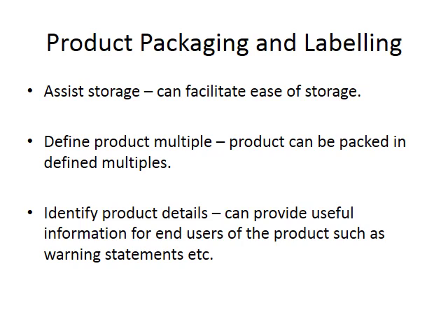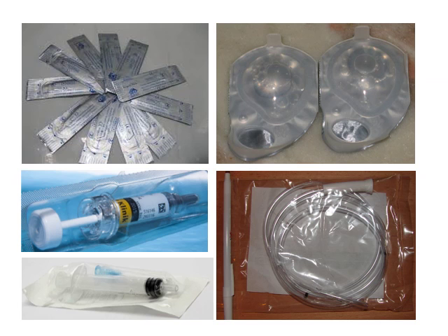It should also assist storage. It should be easy to store the medical devices. The product can be packed in defined multiples, and you should be able to identify product details. Okay, so this is the labeling, which we will talk about later. It should provide information for the end users, such as directions for use, warning statements, lot number, that type of thing.